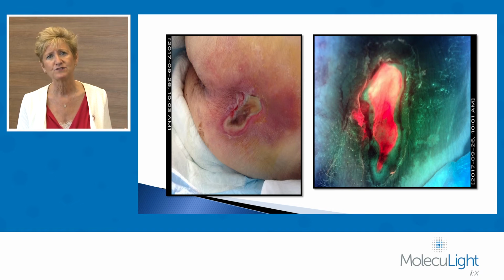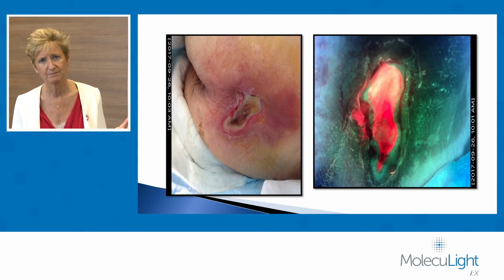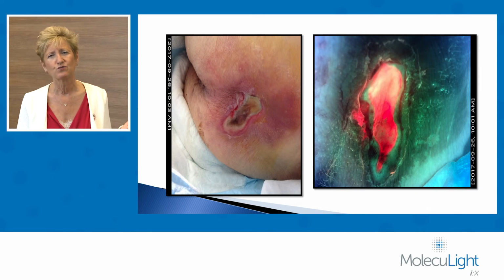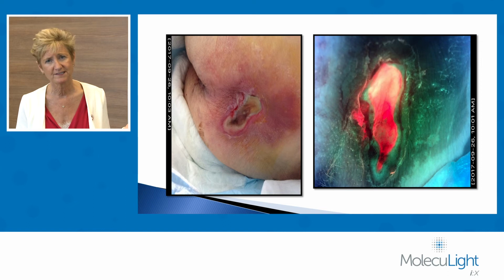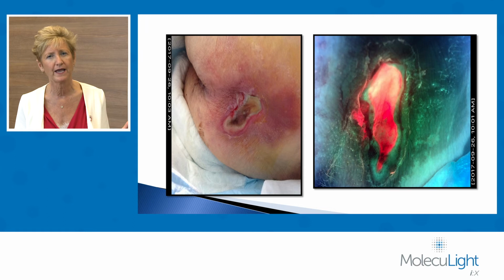And it's interesting to see that, in addition to this wound, this patient also had pain. And so once again, I was able to bring the physician to the bedside and say, I want to talk to you a little bit about what's happening with this wound and the burden of bacteria. And so there was a whole change of thought and plan to the next steps for this particular lady.